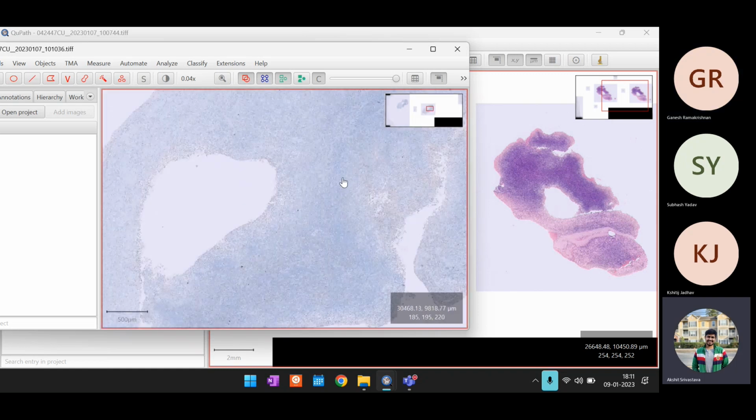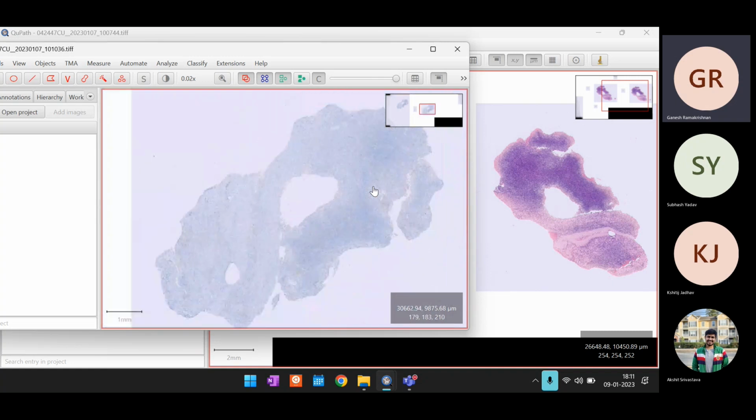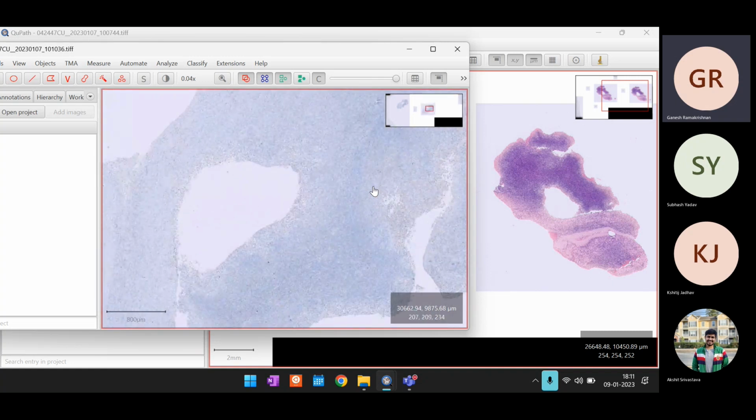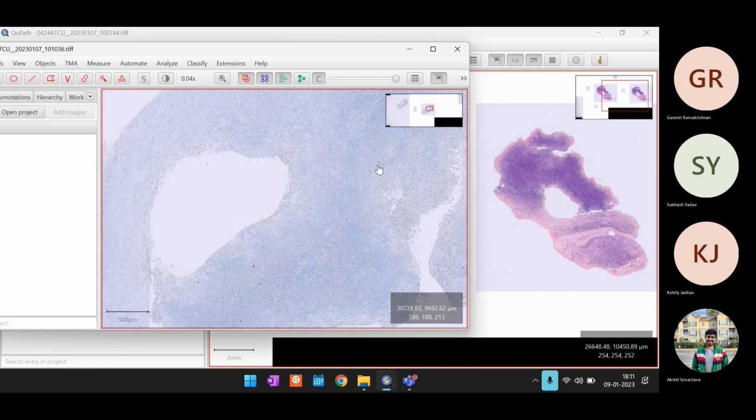The labeling functions are just to identify the Reed-Sternberg cells initially, right? The labeling functions help identify the cells with the ultimate goal of diagnosis. You write labeling functions for a small subtask which form part of the signals to the model overall. You're not going to use a labeling function by itself. The consensus across labeling functions is what will help you give the final diagnosis. Isn't that correct, Kshitij?